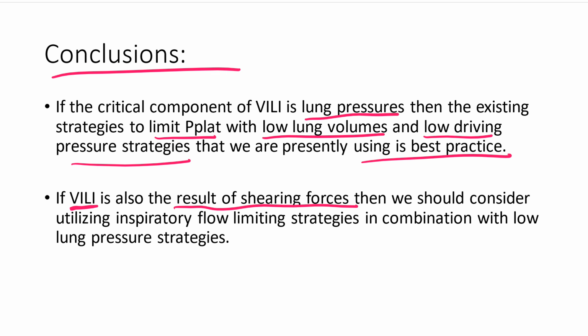Then we should consider utilizing and limiting inspiratory flows, in combination with that, to limit lung injury during mechanical ventilation. So I'm suggesting that maybe we should study that in a controlled environment.